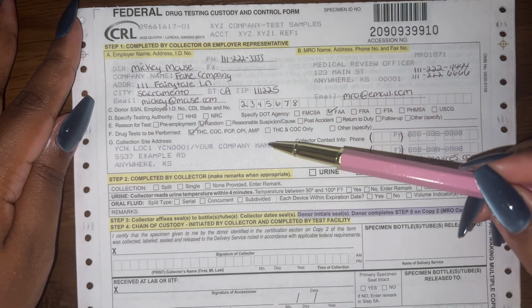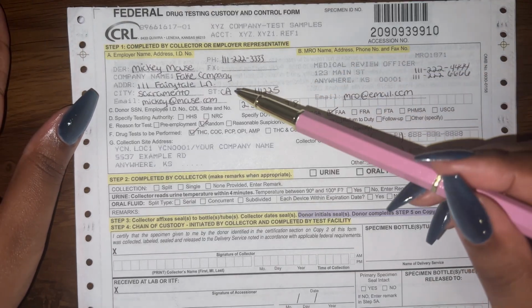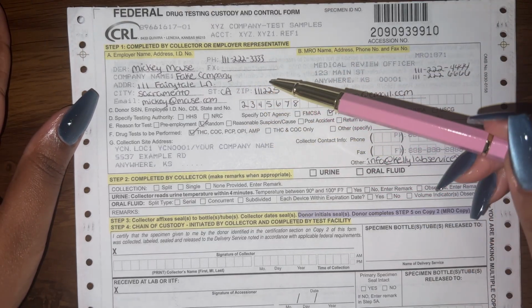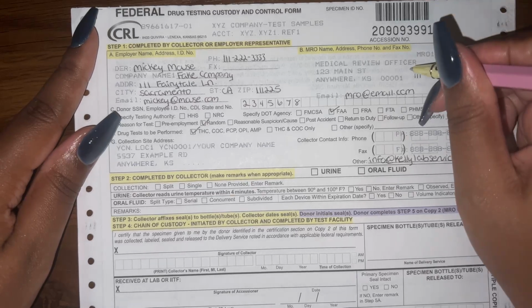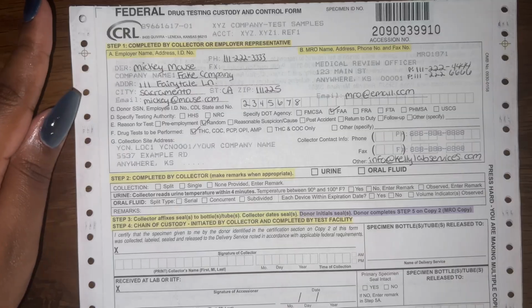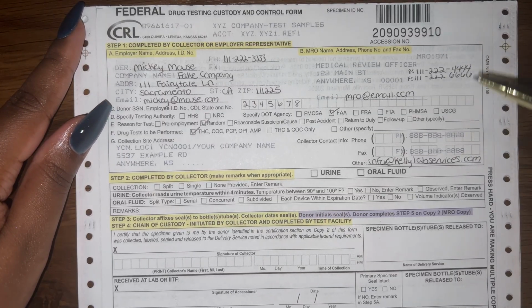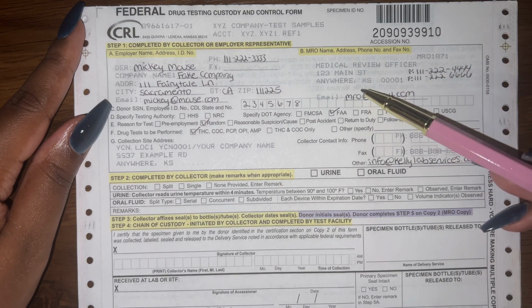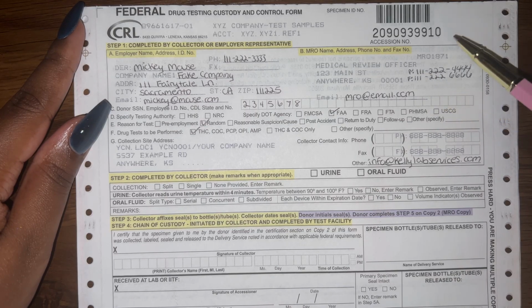We already have step 1 filled in. Of course, in real life, during the collection process, you're going to fill in all of step 1 with the DER's information, the MRO's information, and don't forget about the MRO's phone number and fax number. That's what this is. Let's just put a P and an F there. Especially if you are taking your mock exam through the Kelly Lab training program, you're going to have a CRL training form like this. The MRO's information is going to be missing, so make sure that you read this and notice that the phone and the fax number is missing, so you need to write that in on your CCF.